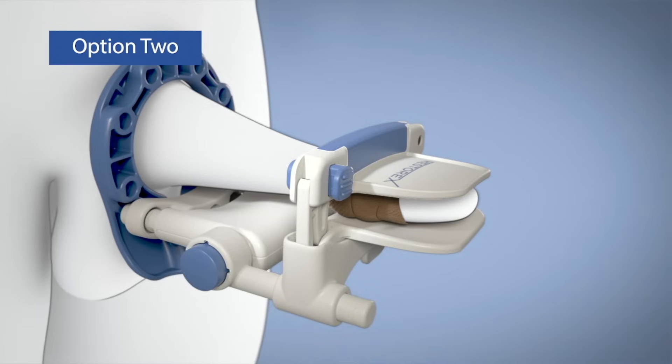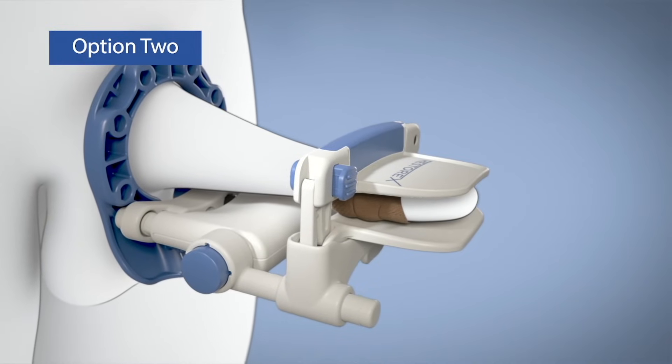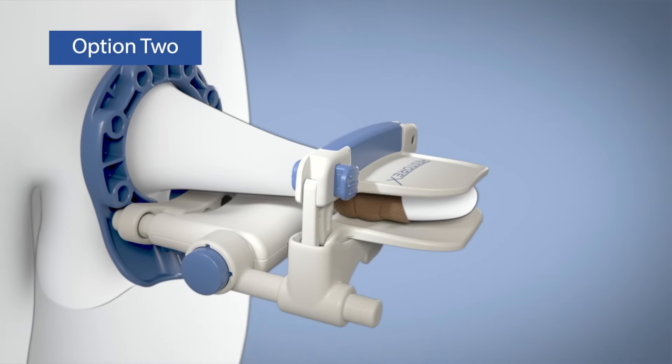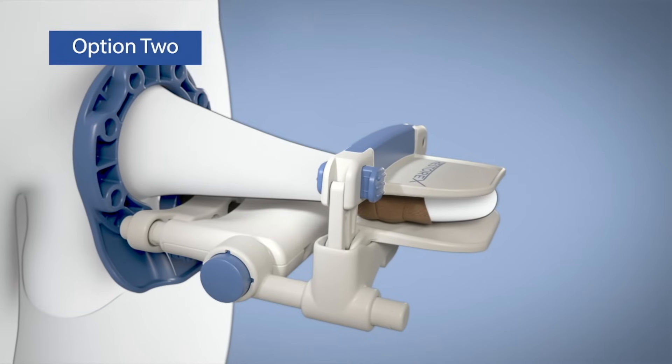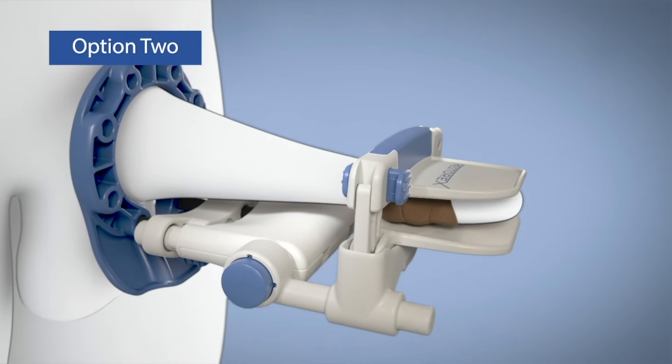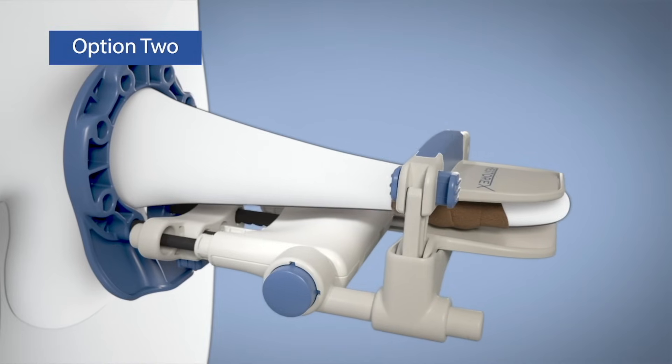Many men have found a second method of extending and adding tension to be easier, particularly those that have difficulty with the head of their penis slipping out of the clamp. First, advance the Restorex device along the extension rods until the penis is nearly fully stretched. Next, slowly and carefully release the tension rods, as shown.